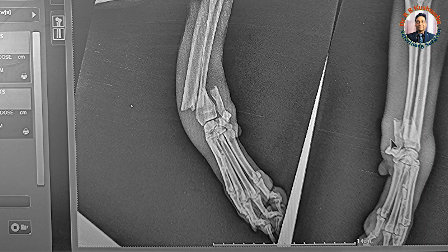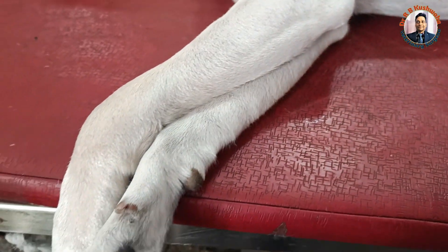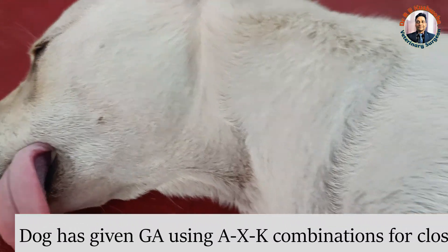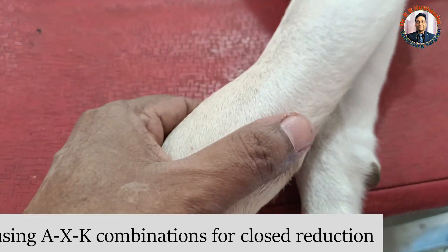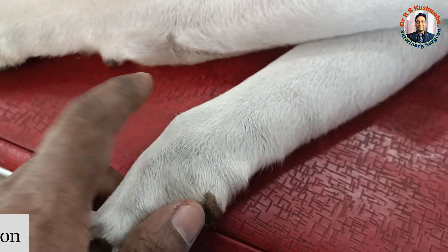In case of the distal one-third fracture, it is very difficult to reduce unless you sedate the patient or put them under general anesthesia. You can see here we have given general anesthesia to this patient so that we could reduce it to the anatomical position. This one is the normal limb for comparison.